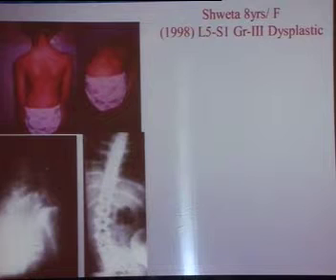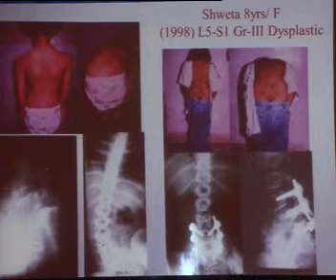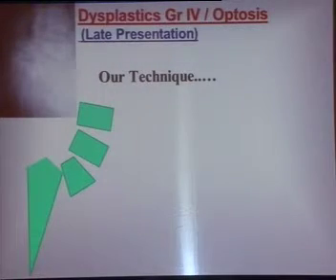One of our earlier cases: often in these dysplastic ones, besides the spine being out of sagittal alignment, because of the dome there's also a shift of L5 in the coronal plane. So a lot of these patients land up with a scoliosis. And when you correct the L5-S1 by reduction, you correct the scoliosis automatically with a shortened fusion. This was an older case, and we did a reduction all from the back, and we did an intertransverse fusion. We now do an interbody fusion routinely.